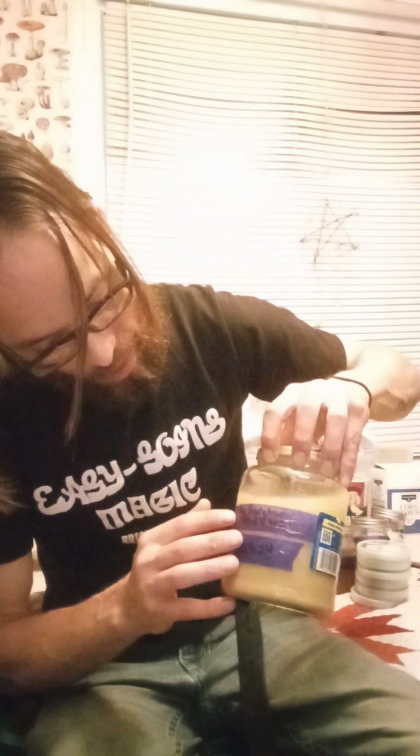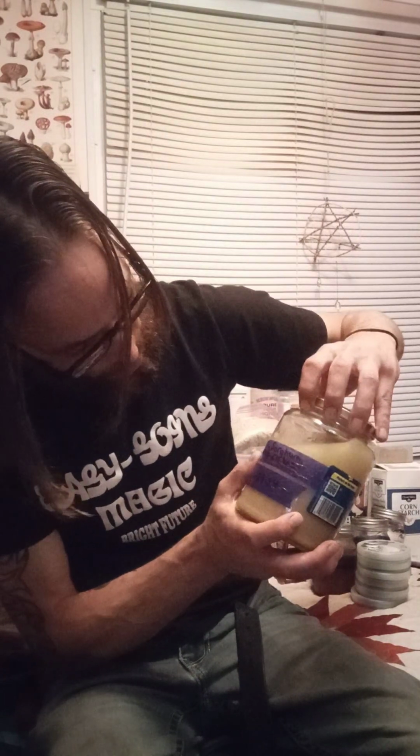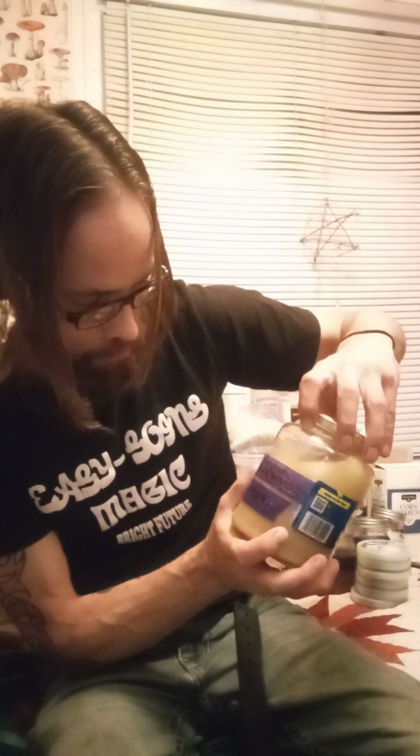I said something wrong in one of my other videos, talking about training mycelium with different broths. It's basically extract, broth, grain water, straw water, whatever, slowly training mycelium to eat certain things. Well, in that video, I collected some straw water. I took that straw water and threw it in a pan with some rice, 10 grams of rice, 10 grams of sorghum pith, 10 grams of oatmeal, and probably 10 grams of potato flakes for 1,000 milliliters.